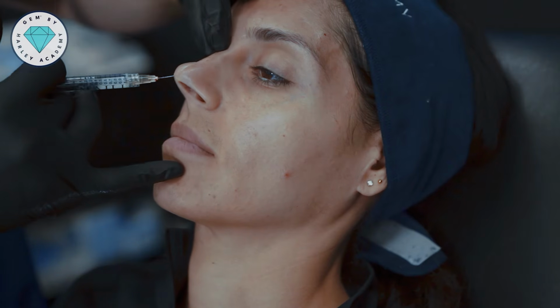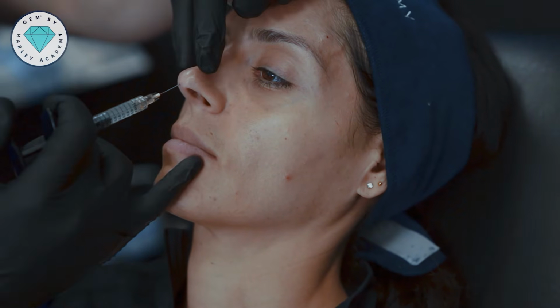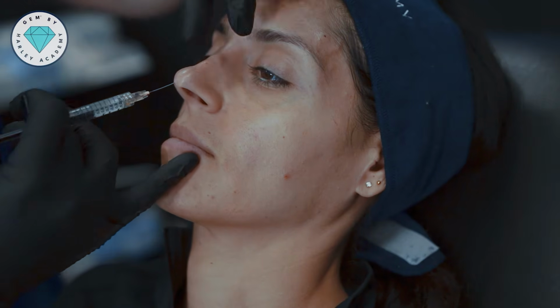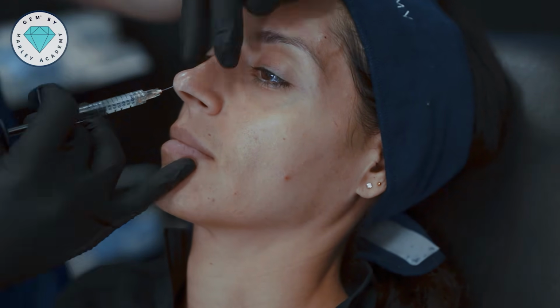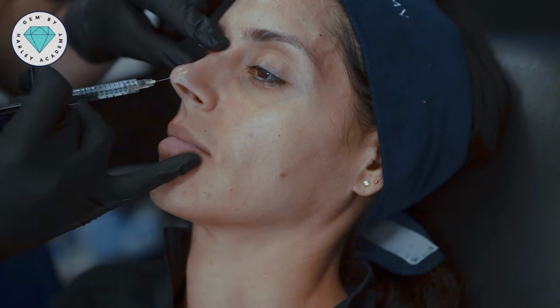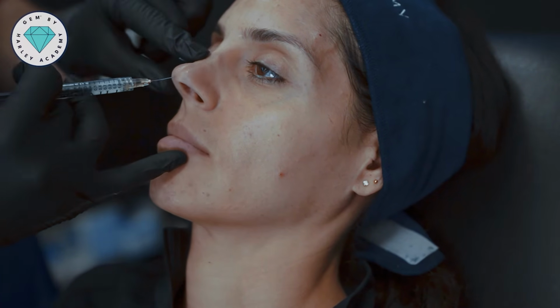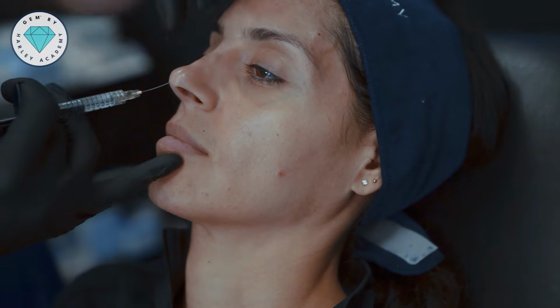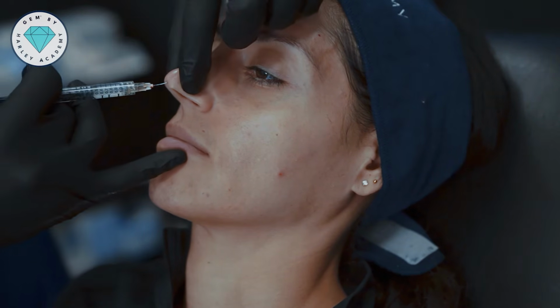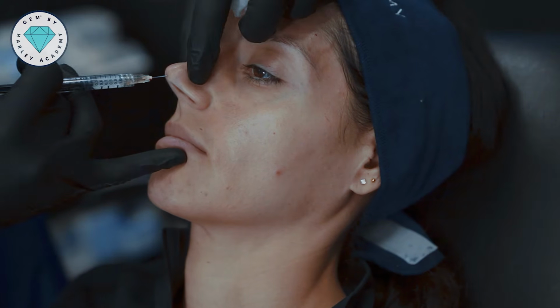Are there any times where you would choose to use a needle over a cannula in the nose? I'm still thinking about that. There are times when a needle can definitely get better results. And in a recent study that looked at all the risks and complications of visual complications, blindness, for example, it was not conclusive about needles or cannulas in the nose.